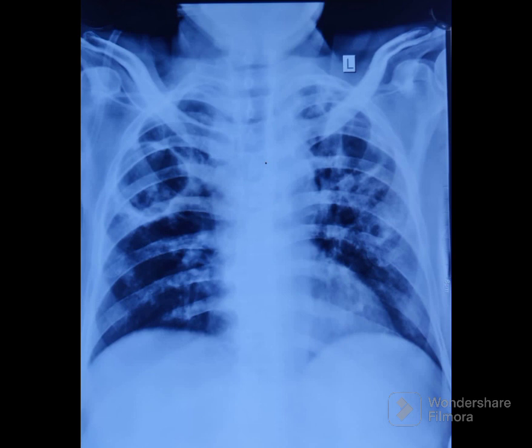Coming back to our chest X-ray: it is a solitary cavity, located in the upper zone. The cavity wall is thin. No outer wall speculations are present. The inner wall contour is smooth. No mass lesion is noted elsewhere in the lung parenchyma.